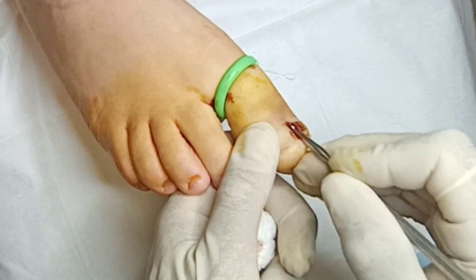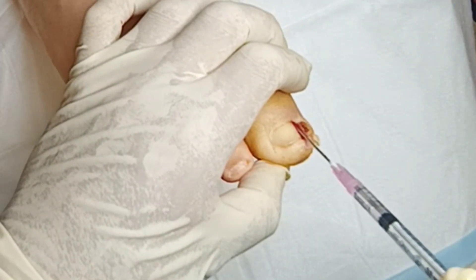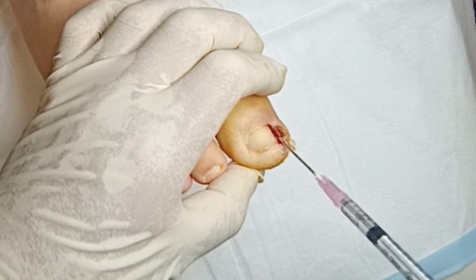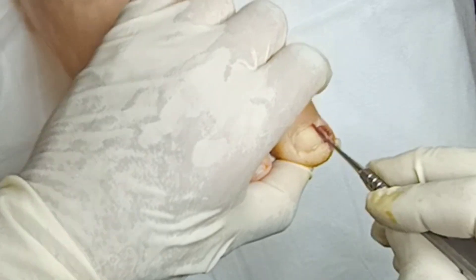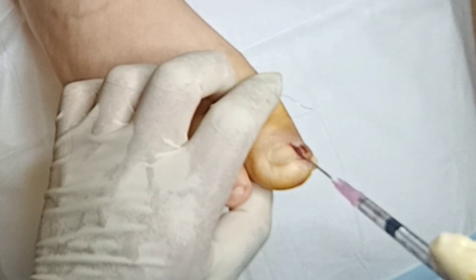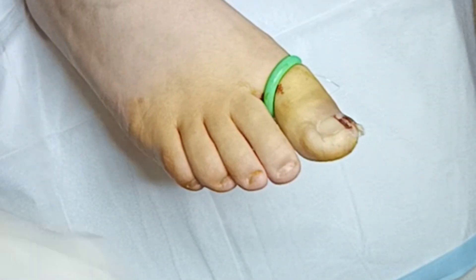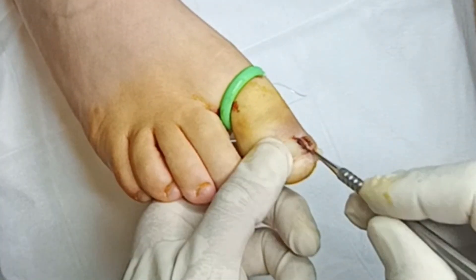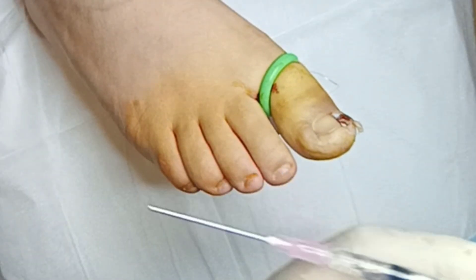Get our file and make sure the edge is nice and clean — that's very, very important. Make sure you don't feel any other areas of nail. Once that's clean, apply the phenol at the end of a drawing up needle — literally just tap it, apply it very slowly. You mainly want to get around the area of the sulcus, but focus primarily on the matrix area. Normally I apply it once, then take the blacks file and massage it into the matrix to make sure it penetrates. I'll do that two or three times, applying and massaging for about 15 seconds each time, up to three times total until I'm satisfied. We need to cauterize the area because we don't want the nail to grow back — we need to cauterize the matrix.